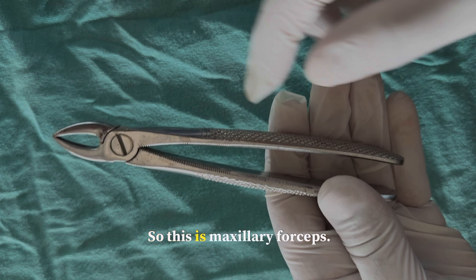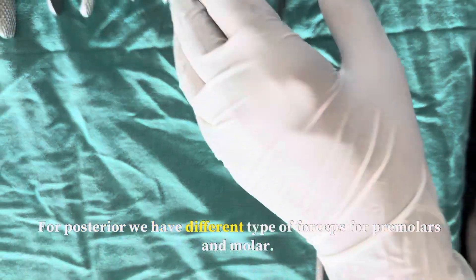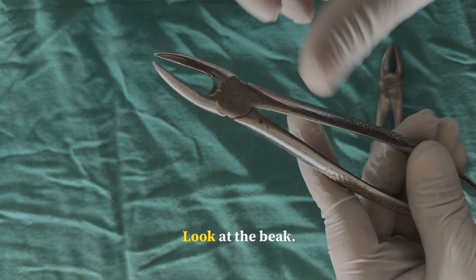This is a maxillary forcep. For further identification, look at the beak — it is closed, so it is a maxillary anterior forcep. For posteriors we have different types of forceps. For premolars and molars, this is a premolar forcep. Look at the beak — it is slightly open.